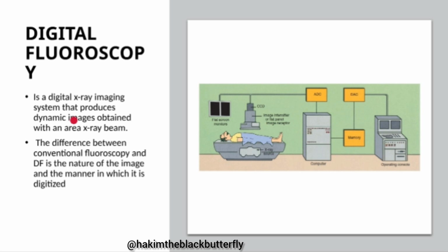And most of the dynamic images of the digital fluoroscopy are of really good quality. First, mainly the contrast and the resolution are going to be very good because at the end, we are going to see that the CCDs and the flat panel detectors are made up of pixels. And at the point of manufacturing and also purchasing, we can really determine what we really want.